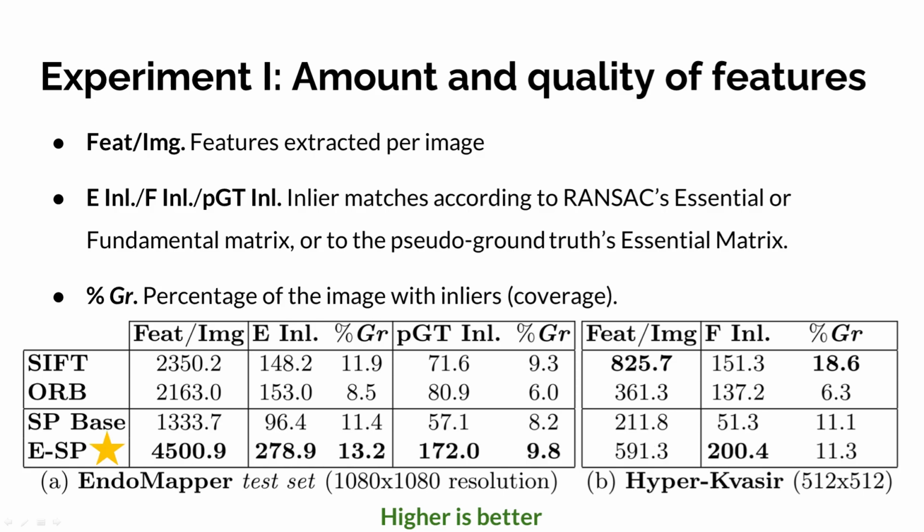In these metrics, our model performed better than the others, especially in the ENDOMAPPER test set. The HyperKvasir test set is very different from the one used to train the network. The model performs well, but the improvement is not as significant.